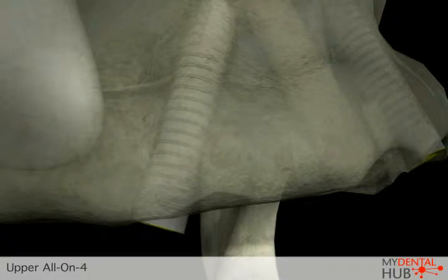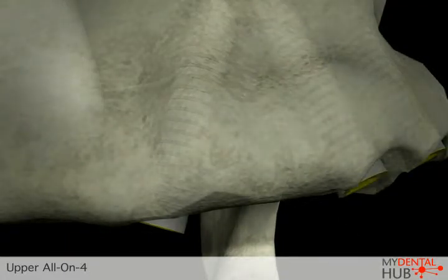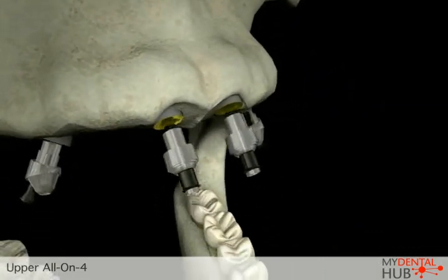Once the implants have been placed, they are used to support the final restoration, allowing you to chew in comfort and improve your nutrition.